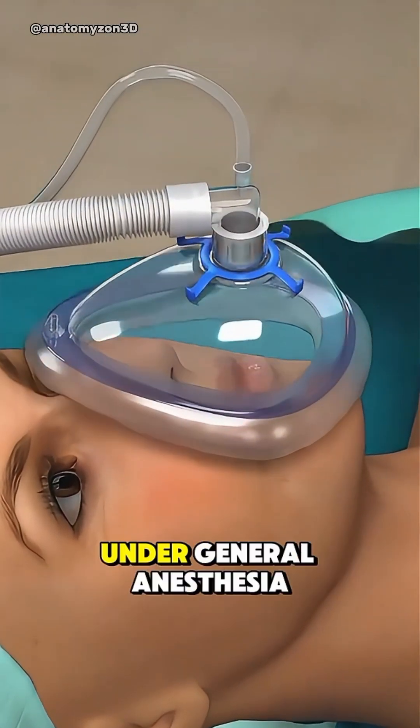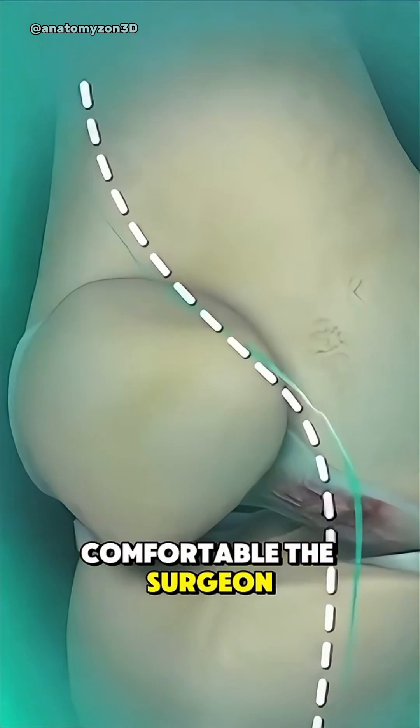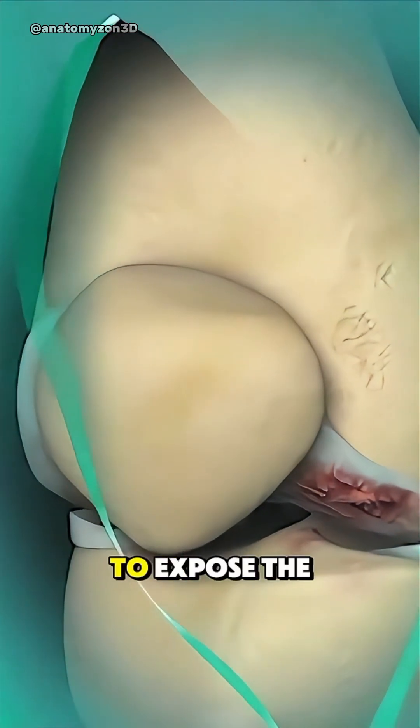The procedure starts under general anesthesia to keep you comfortable. The surgeon makes an incision down the front of the knee to expose the joint.